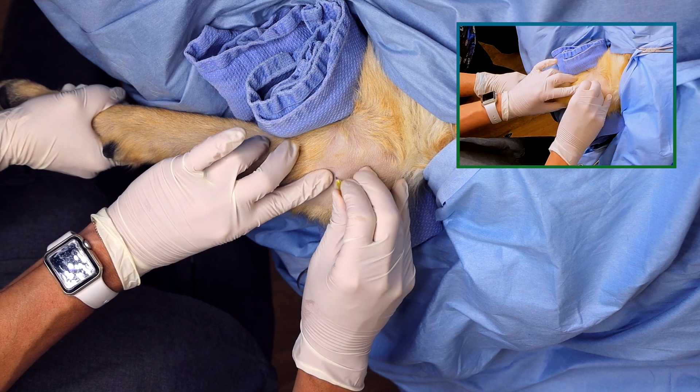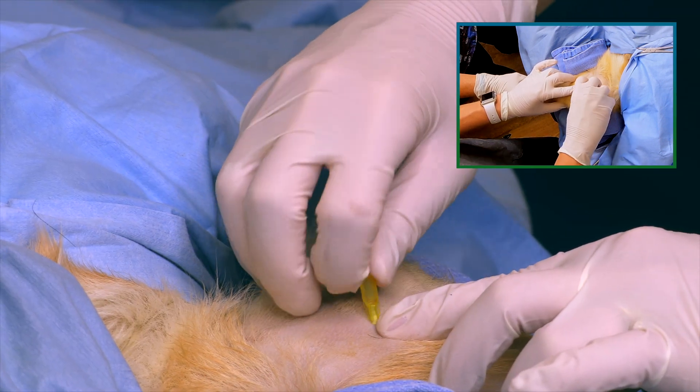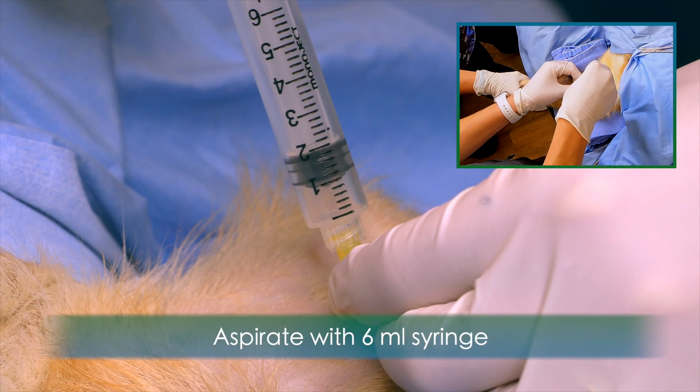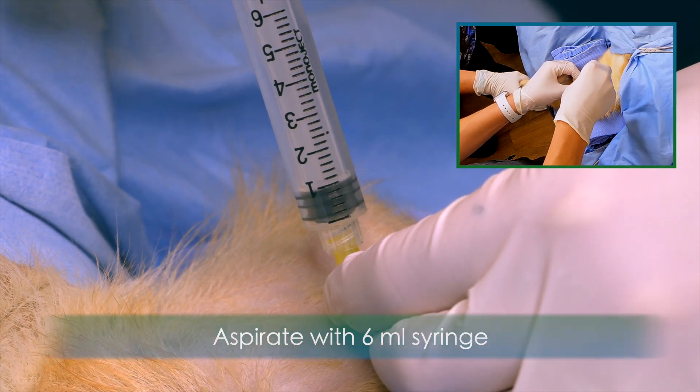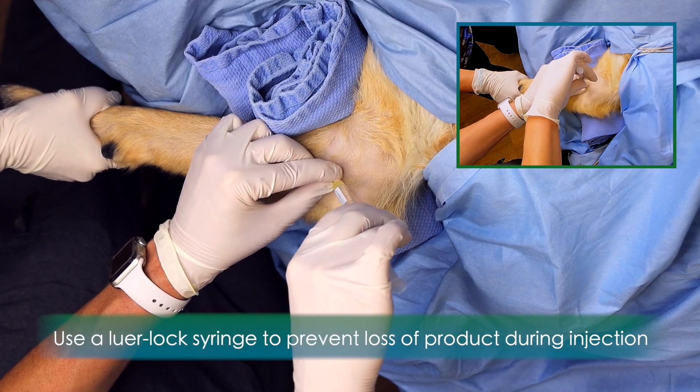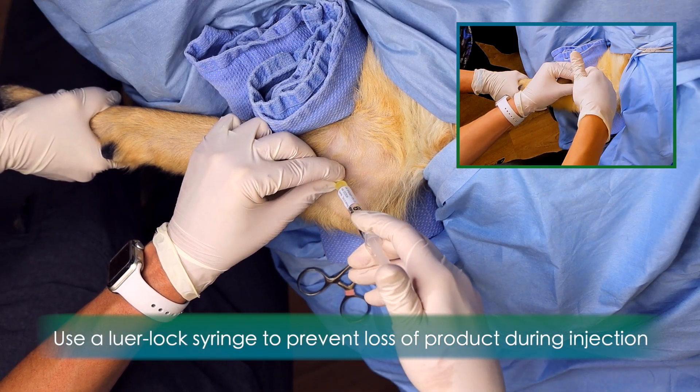Advance the needle into the joint and rotate the needle to clear the bevel and observe for joint fluid. Aspirate with a 6-mil syringe. Make sure to use a luer lock syringe to prevent losing the connection to the needle during your injection.